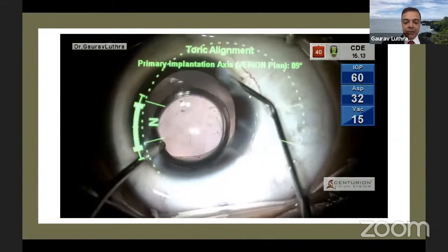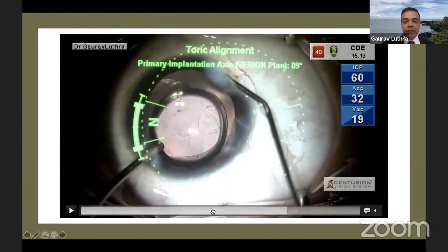Here I like to pause it. I've completed the placement of the toric IOL. I've done a hydroimplantation with a CTR. Now I'm not going to take out my infusion from the left hand. My hydroimplantation was done, and my chamber is always going to be formed completely throughout the procedure. With the chamber formed, I'm hydrating my wounds, so there is no fluctuation in the chamber which can make the toric IOL rotate inside. This is another thing which really helps.